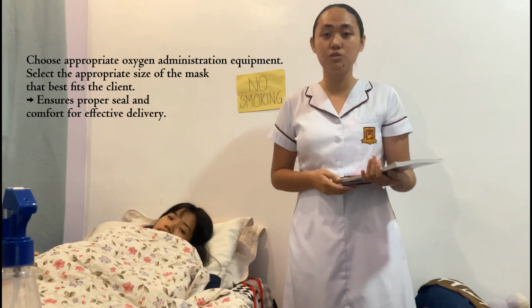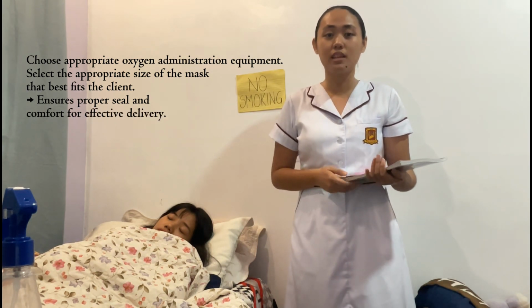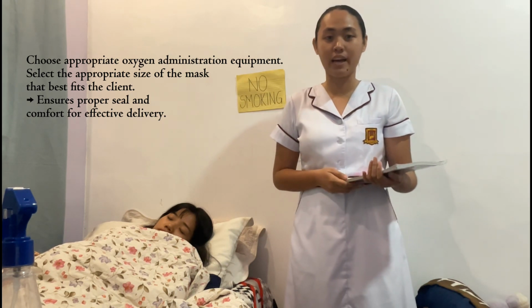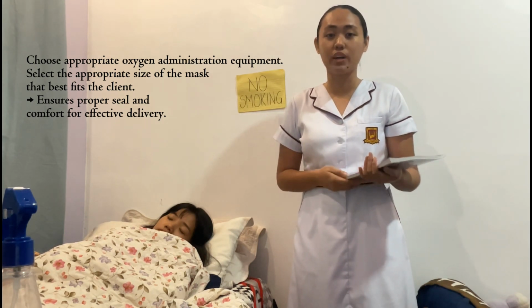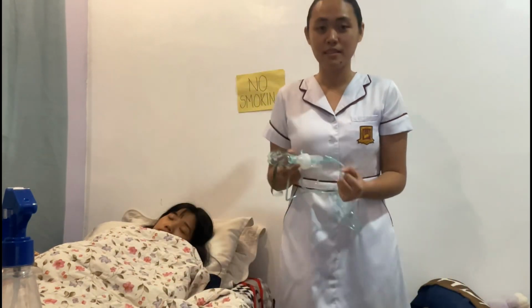So we are going to choose the appropriate oxygen administration equipment. So select the appropriate size of the mask that best fits the client. So we do this to ensure the proper seal and comfort for effective delivery. So this will be the mask.